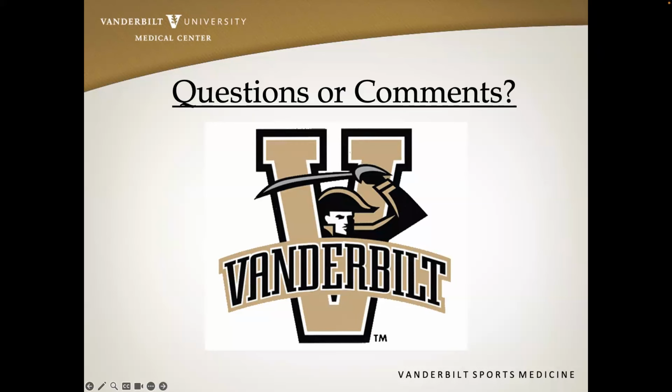Yeah, nice job. Great start for the fellow series. I'm probably going to reiterate some of your points, Stephen, but I have a pretty low threshold for radiographs in the knee. And Thea, I think your comments about whether ultrasound is appropriate is a good one. Certainly in this case it was.